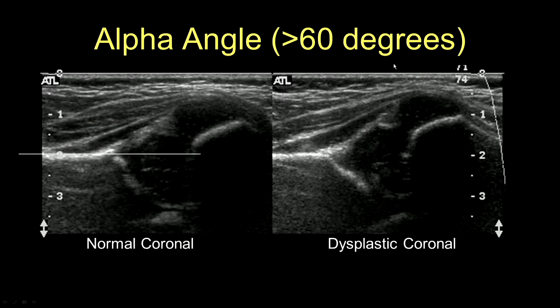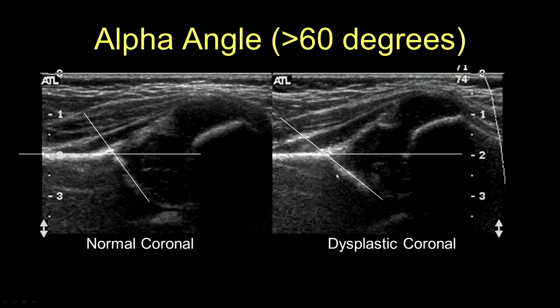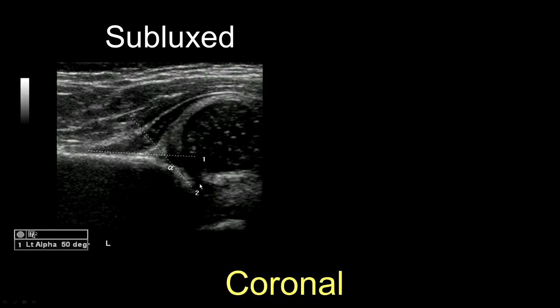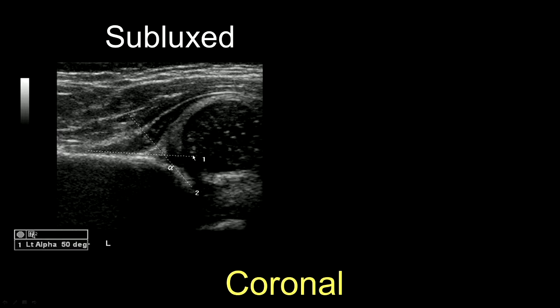The alpha angle should be about 60 degrees in the normal coronal plane. Here we have a dysplastic angle which is much more acute. Notice also that this acetabular rim is less well-defined. This is a subluxed case where the alpha angle is very acute. You can see that the femoral head is not bisected by the line through the iliac wing — the femoral head is partially out, and the acetabular rim is poorly defined, which is a very good indication of hip dysplasia.